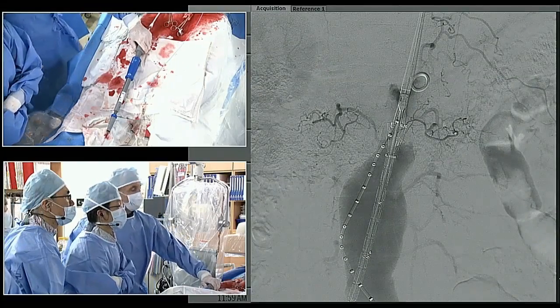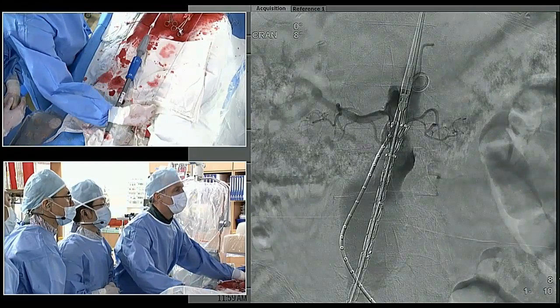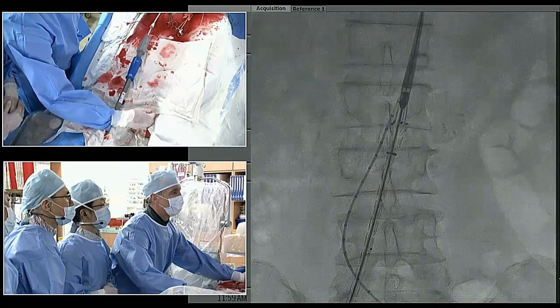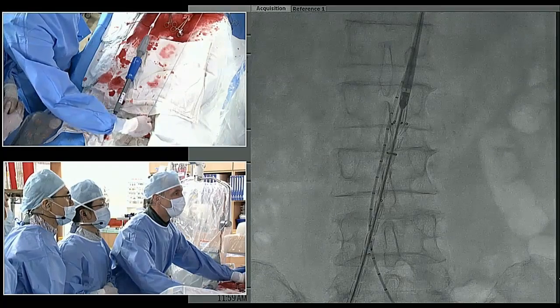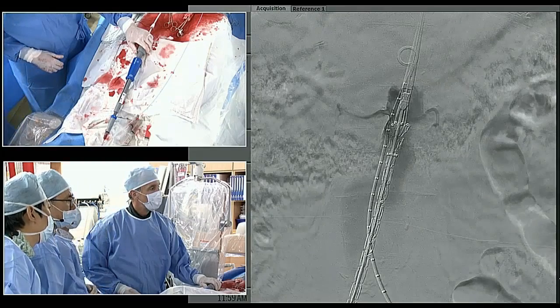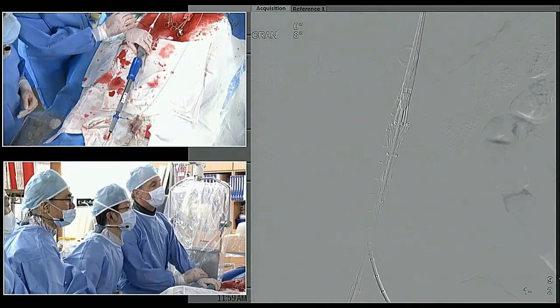You can see you're plenty low, so I'm even going to have to scroll. No, I think that may be right, actually, Bob. I'm just going to spin this pigtail and see if I can get a different filling pattern. Yeah, you may want to go up a little bit. There you go. Okay, let's try that. Here we go. Yep, I like that. Yeah, it's a good placement.